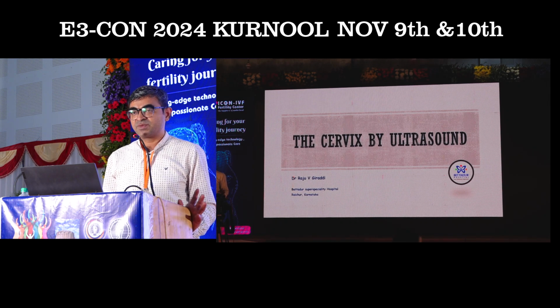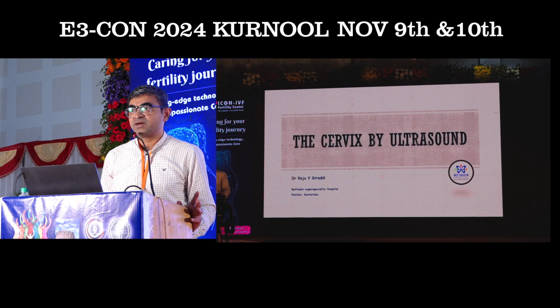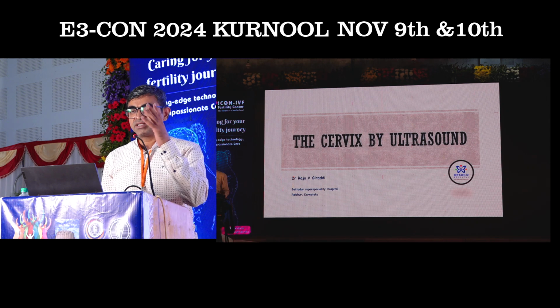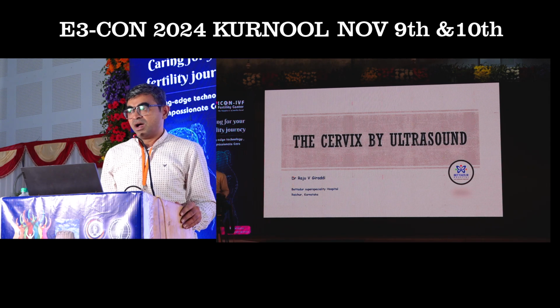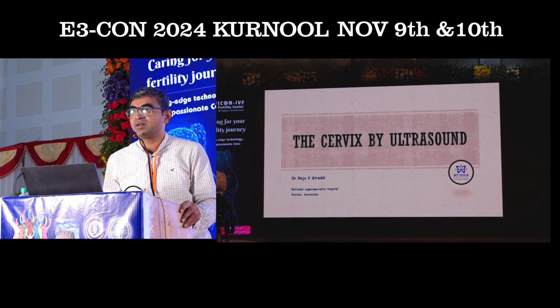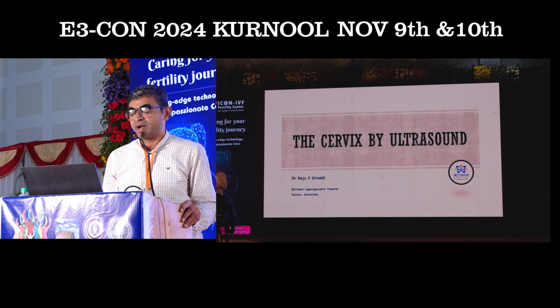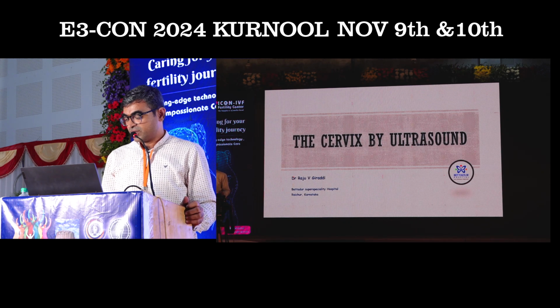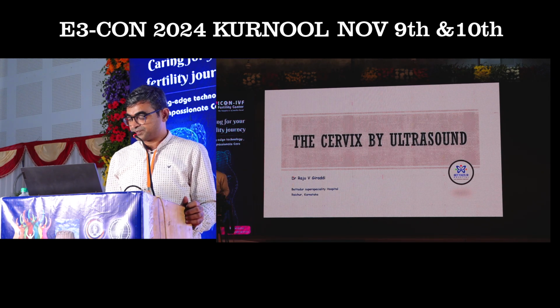Now you can ask me why I need to image the cervix when I am able to see it in the per speculum examination. Yes, definitely we are able to see the cervix and cervical lesions on per speculum, which is the external, vaginal part. What about the endocervical part? Sometimes there is a protruding lesion, and you need to know whether it is actually a cervical lesion or whether it is coming from above. So now you would have seen the orientations of the probe.